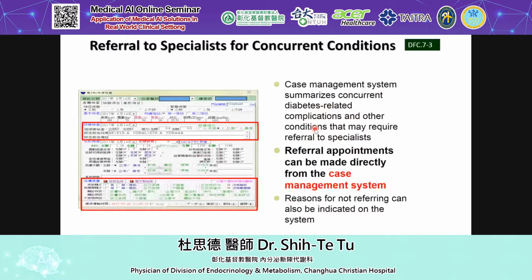So this is the original patient workflow at CCH. When patients come to our OPD, we assign them to do the DR screening. Then our educator or our technician will take a color fundus image for the patient. As Professor Hsieh said, the ophthalmologists do not want to interpret these simple fundus images. So the job depended on our endocrinologists to interpret the image and sign the diagnosis report. After we finish the report, if any abnormality is found, we refer them to the ophthalmologist for treatment.